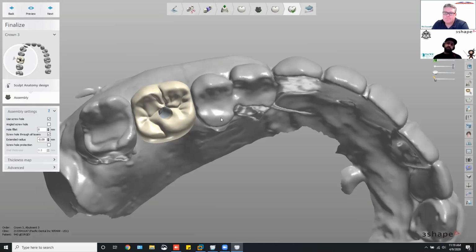And you can actually alter your own libraries. I know in 3Shape you can. Pretty sure in ExoCAD you can go in and edit the current library, make a copy, and morph it around to your liking and smooth it out. That's really up to the users themselves to figure out. But definitely, the library is key to how well you design a single case, because you don't want to sit there and do 500 or 1,000 clicks.